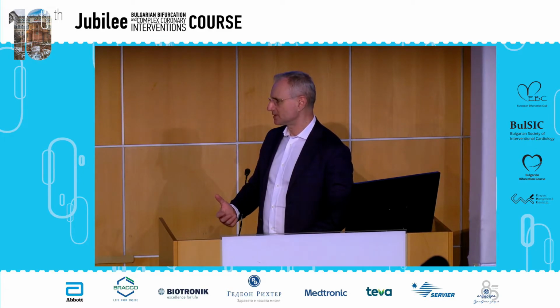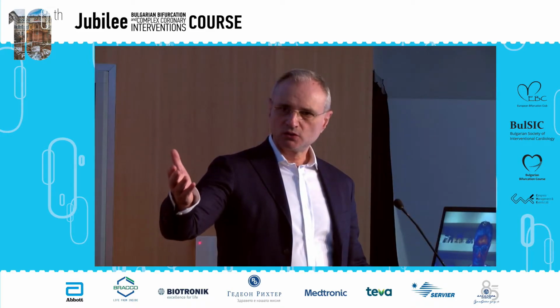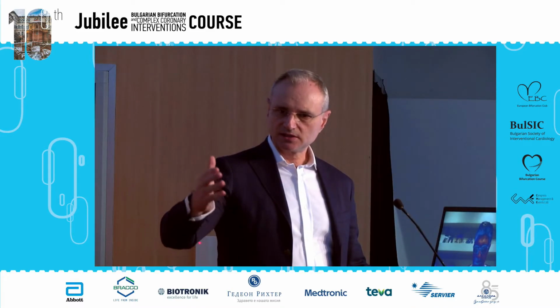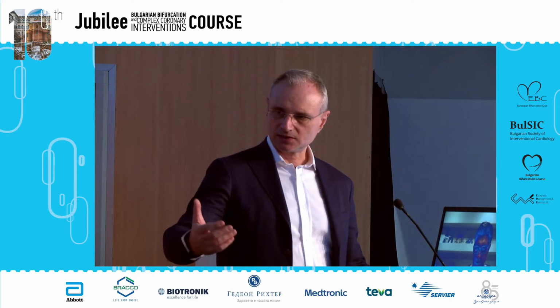The main rule someone should follow is that the more elegant the crossing, the less material implantation will be required. Yesterday we would have finished with a single stent crossover, not very long, but it was necessary to implant 68 millimeters of stent in the direction of the distal circumflex.